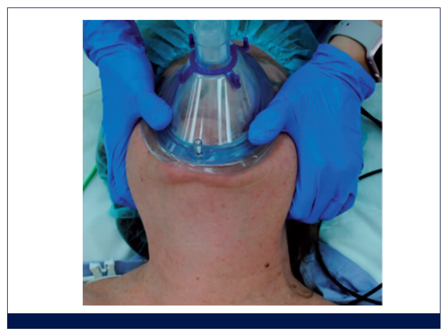What I prefer to do is to actually reverse my hands in a difficult mask ventilation. So put the thumb on the mask and get all 4 of those fingers behind the angle of the jaw and lift up.